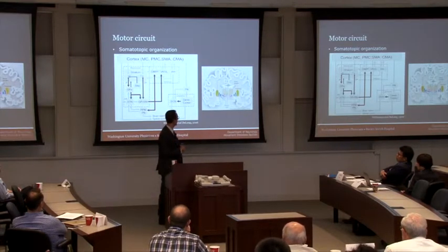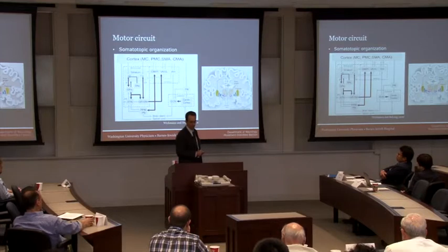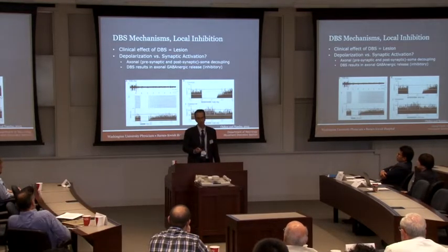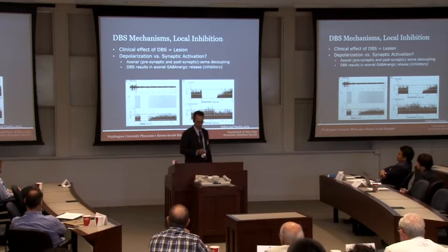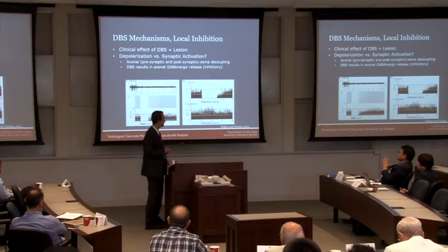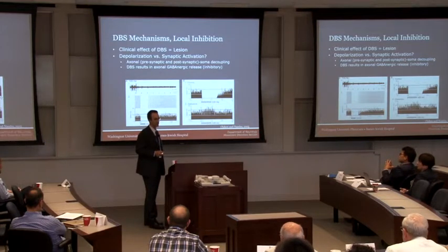This here is just the anatomy demonstrated, indicating that this basal ganglia structure is deep subcortical, and hence the term deep brain stimulation. So thinking about mechanisms of DBS, we always want to understand better what we're doing with this, even though we have a kind of serendipitous empiric formula that works for us as clinicians. The initial hypothesis was that the effect is equal to a lesion. We scooped out a portion of the brain, and we have the same effect when we send in a wire and pulse electricity through that.